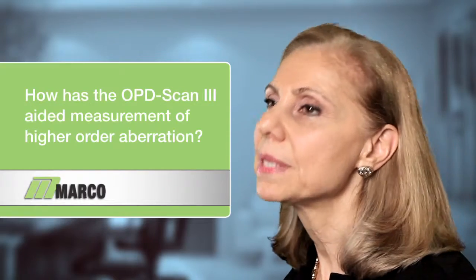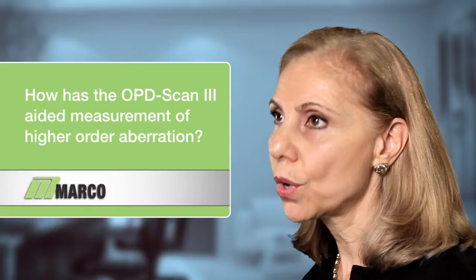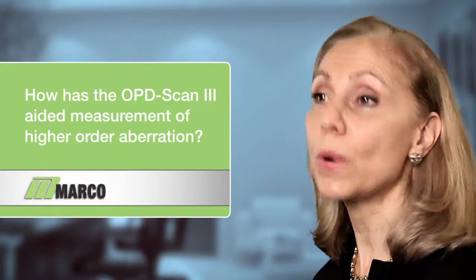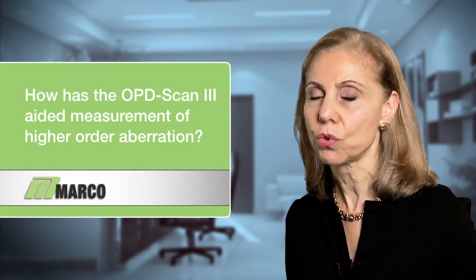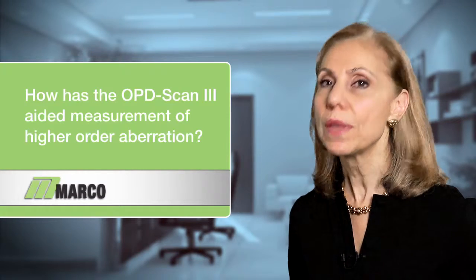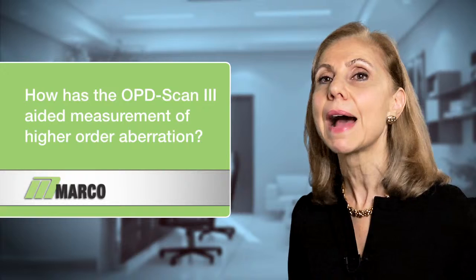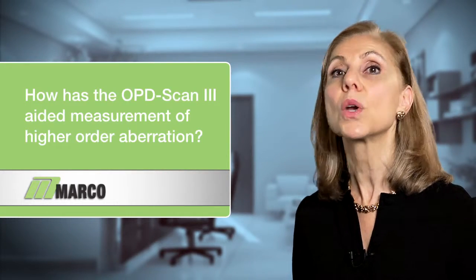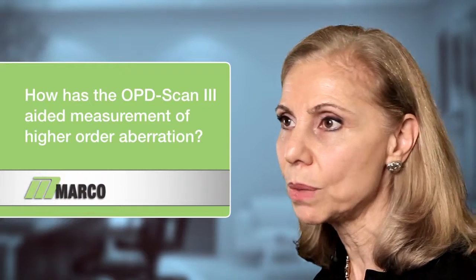One of the maps that's available on the OPD-3 is the higher order aberrations, which we can display to the patients through point spread function, pre and post cataract surgery. And I use this with every one of my cataract patients. I'm able to show them exactly what their vision looks like looking at a source of light with their cataract in place, what that point source of light will look like after their cataract has been removed.